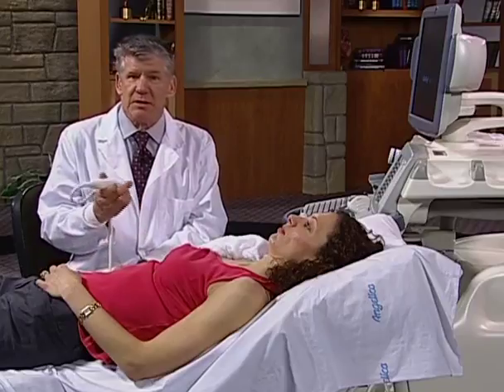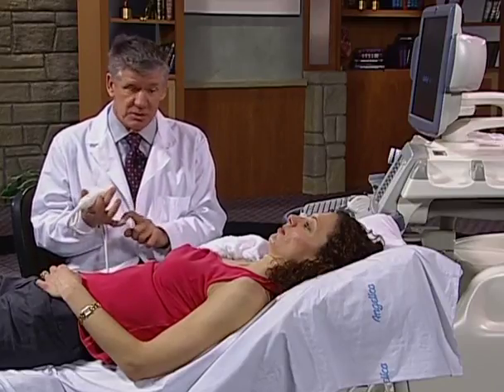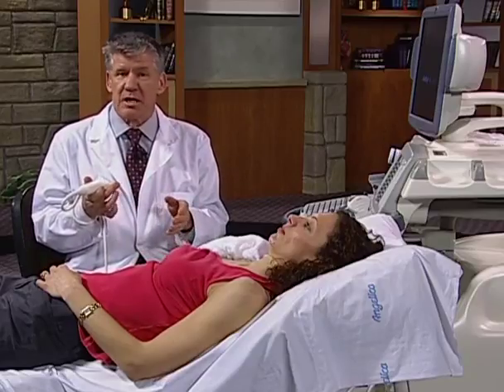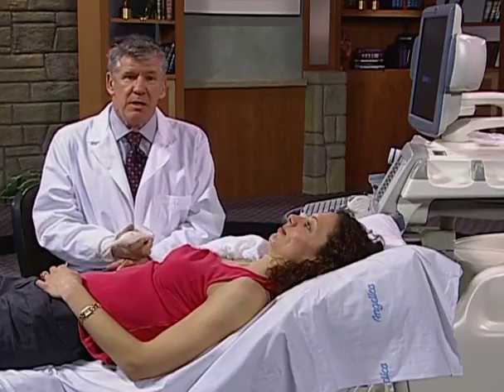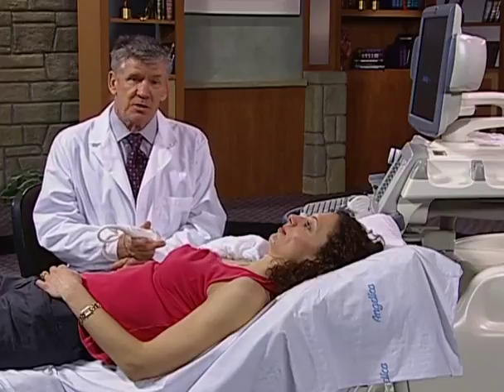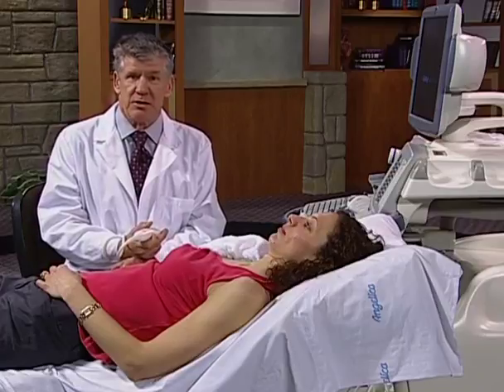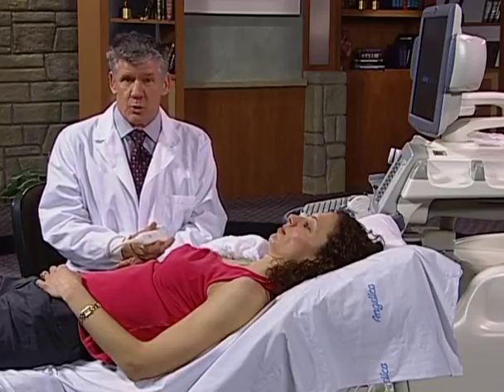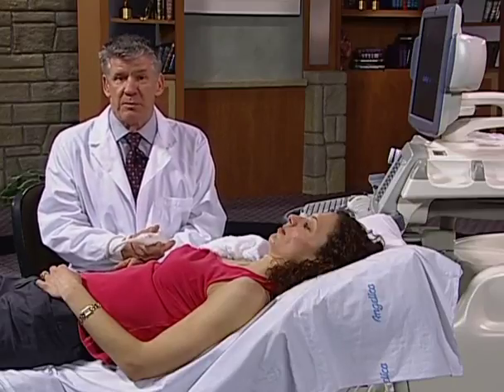Let me just reiterate that the purpose for this is to identify, number one, if there's subclavian stenosis. So if there's no subclavian stenosis, and we don't get that post-stenotic flow or high velocities, and for that matter, ditto for the innominate, then the next thing we may be looking for is the possibility of subclavian aneurysm. So we look carefully around the clavicle along the subclavian artery for that condition. Next, we try and identify if the patient has a high origin of the radial artery and if the radial artery is suitable for a bypass graft.